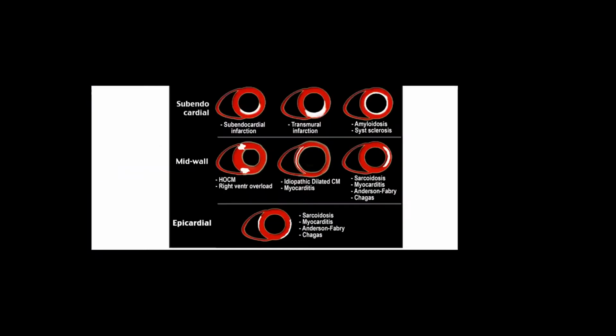Now, CMR. What should we know about CMR for the sake of the board? We just have to know this one. This is slide only, I think. But of course, we know that cardiac CMR is the best, or now the gold standard, of viability assessment. And it can settle disputes about valve quantification. When the echo is not the final answer, you can go for CMR.